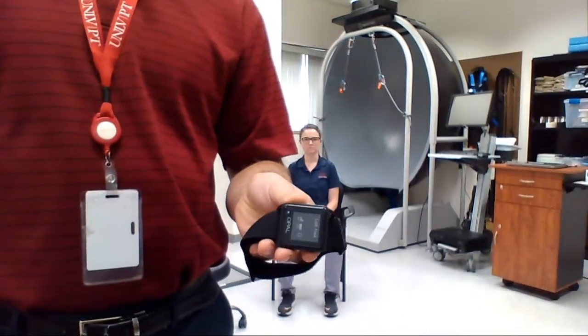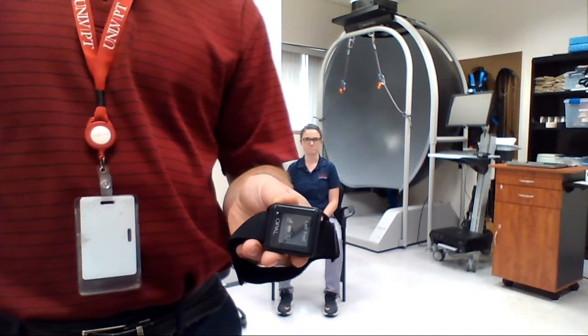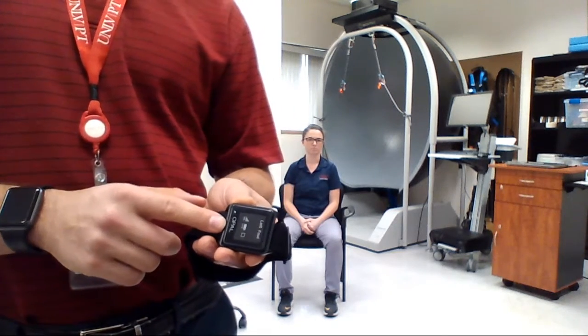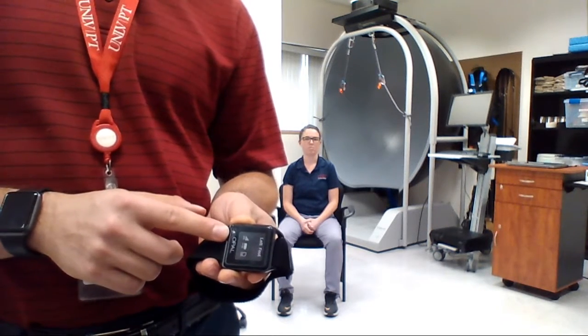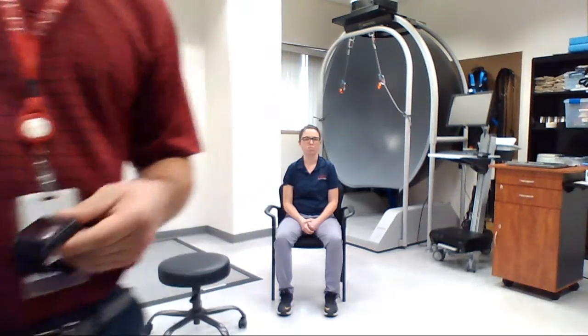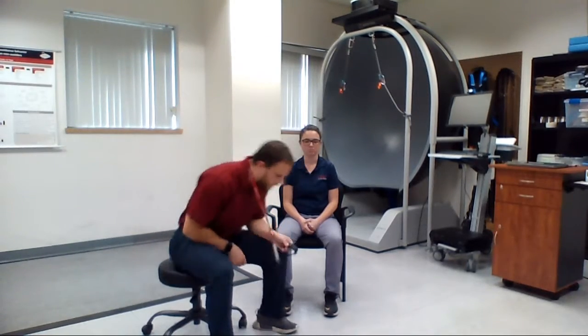Again, making sure that all of the Opal sensors as well as the access point are flashing with the green LED light. You're now ready to begin putting the sensors on the patient. For all of the sensors, you're going to want to have the flashing LED light pointing in the proximal direction on the patient. For the foot sensors, you're going to place it just over the dorsum of the foot with the screen facing up.